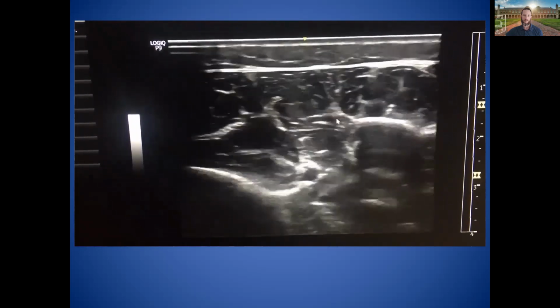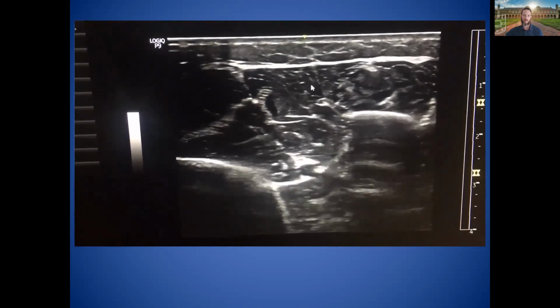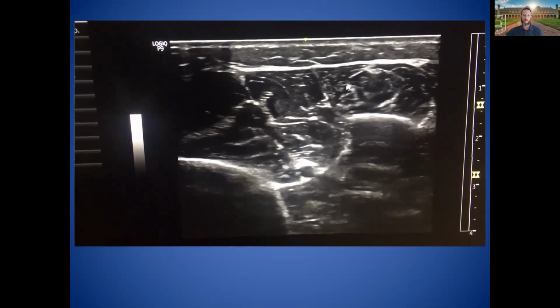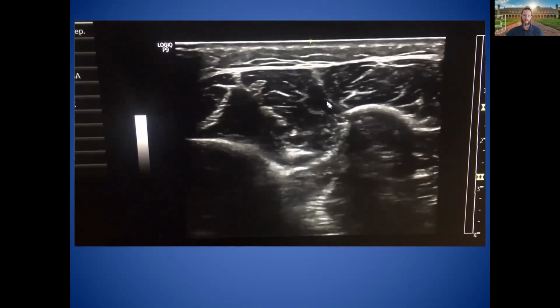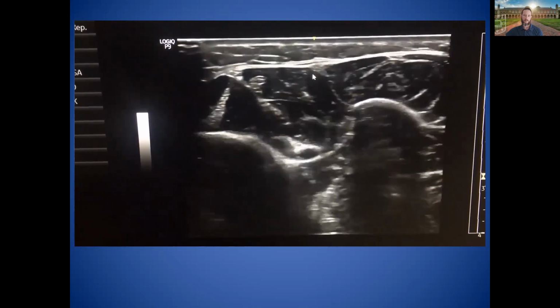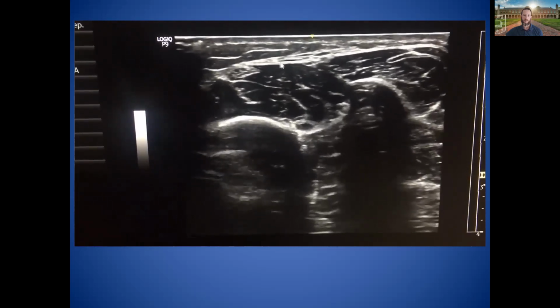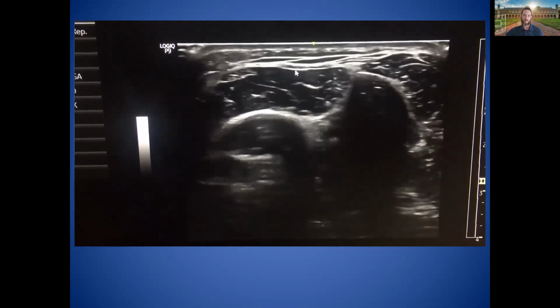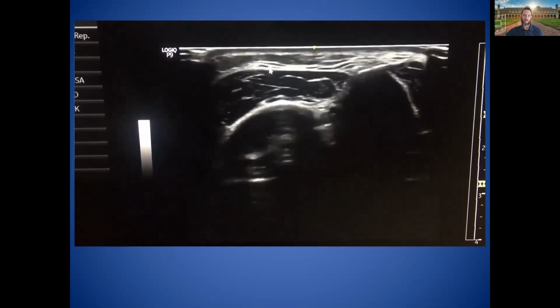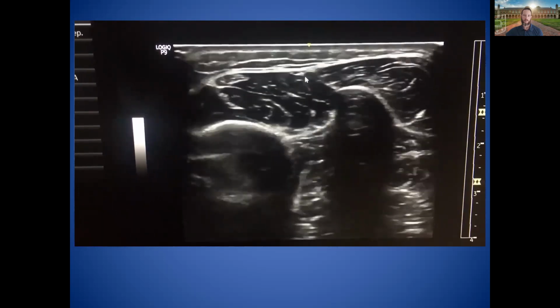what it's going to do is arrive right here through the fascial plane between the extensor digitorum longus and the peroneus, I believe this is the brevis. So you can follow this fascial plane, and you can see here the nerve is sort of arising toward the fascia, and what you're going to see it do is cross the fascia right there. And so that is the superficial peroneal nerve.